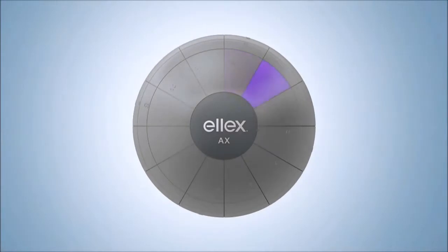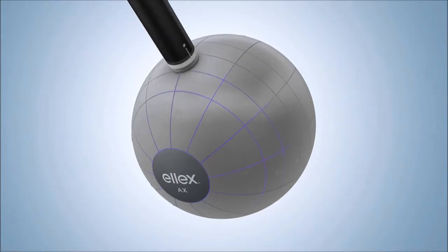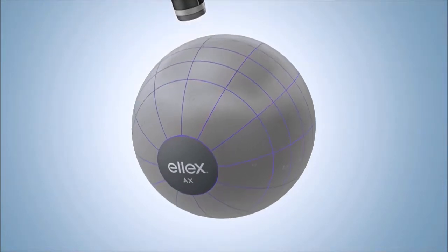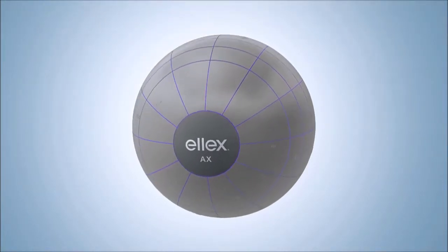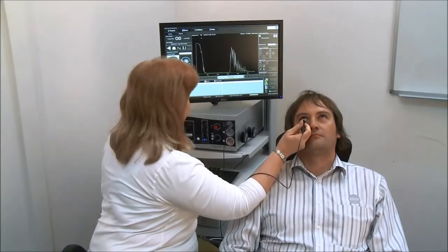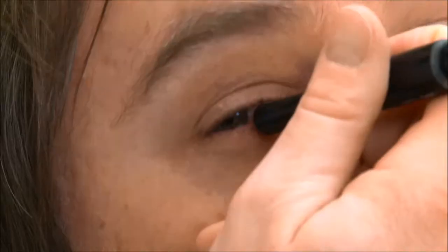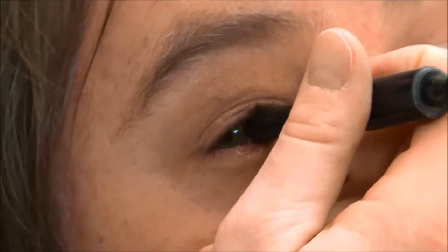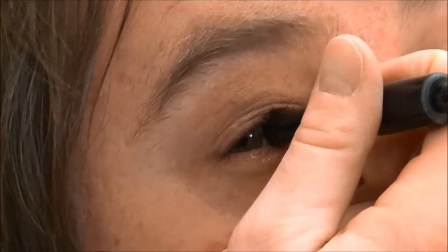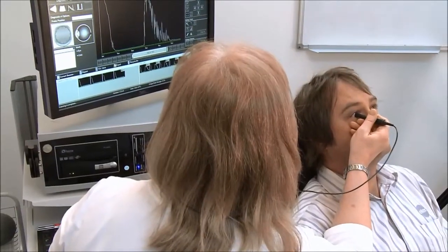The eye is visualised in hours as on a clock face. Then each hour is imagined as a line running from the limbus to the optic nerve, rather like lines of longitude around the earth. As the transducer is fixed, the examiner will move and angle the probe to scan the eye.